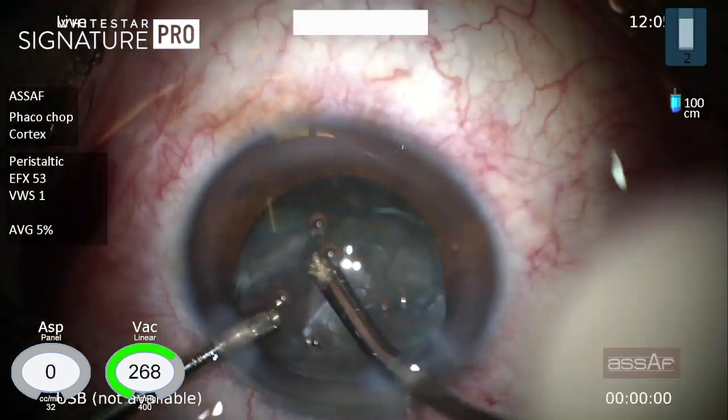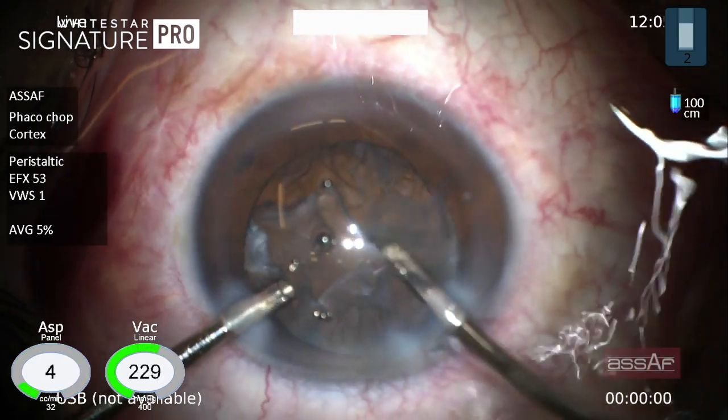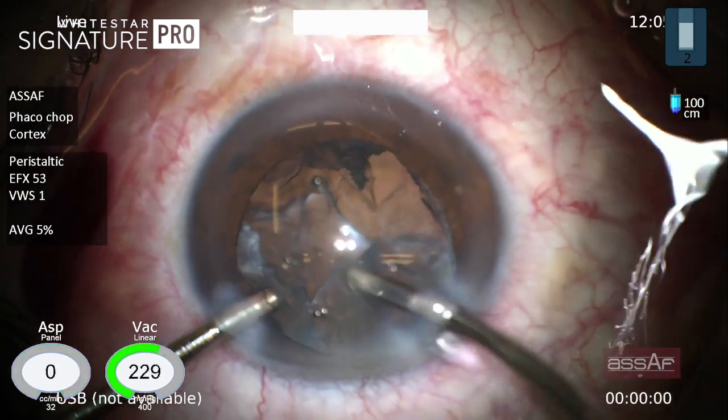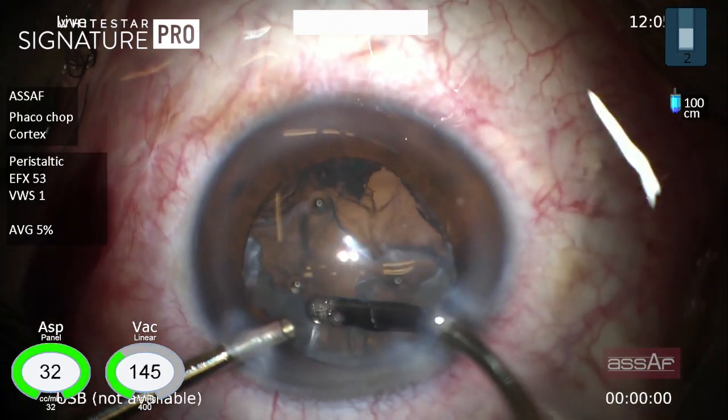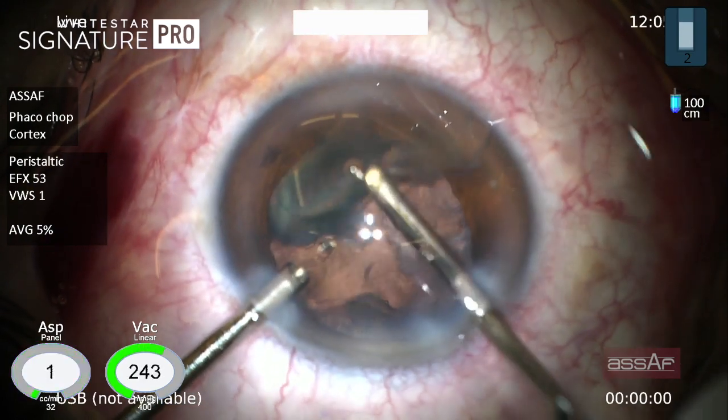Now moving to the next stage, which is irrigation-aspiration for cortical cleanup. Remember that we did not do hydrodissection and we are left now with a thick epi-nucleus, which can be washed out easily with irrigation-aspiration.